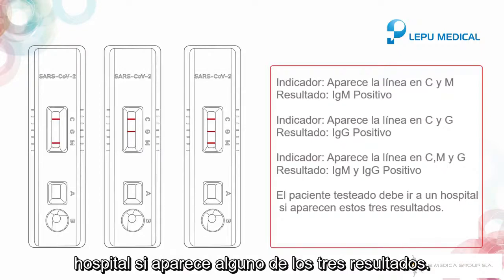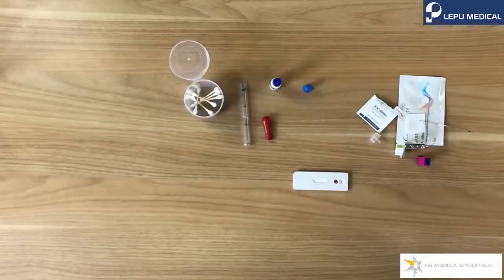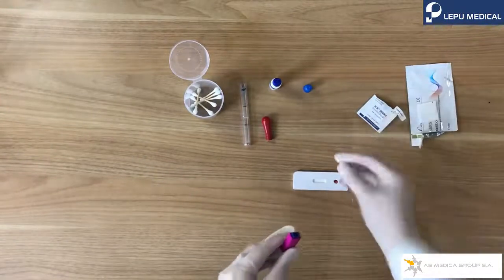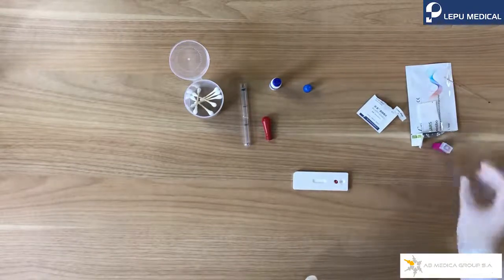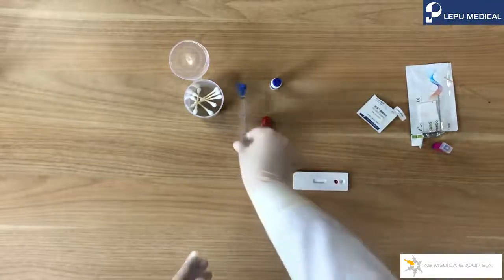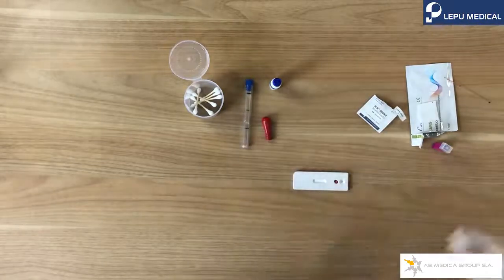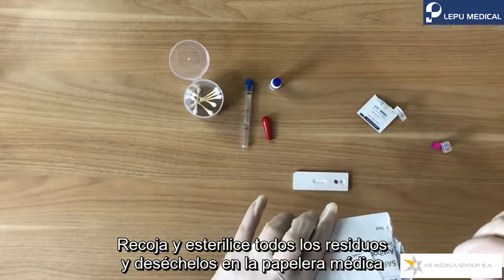The tested person must go to the hospital if any of the three positive results shows up. If you did not see the C line in the result, then the test is invalid. Collect and sterilize all the waste and discard them into the medical waste bin.